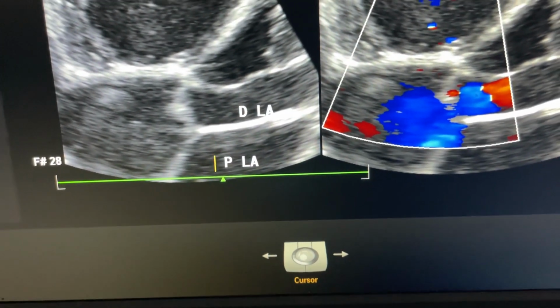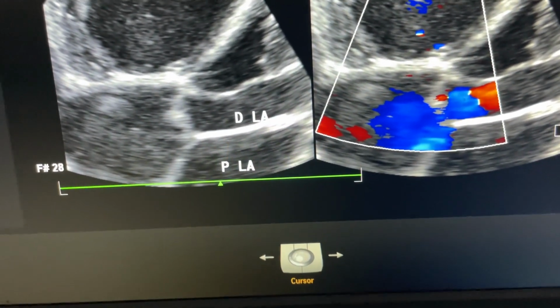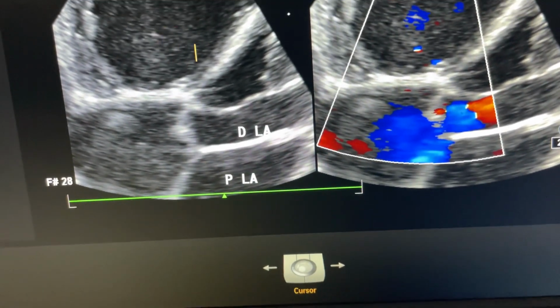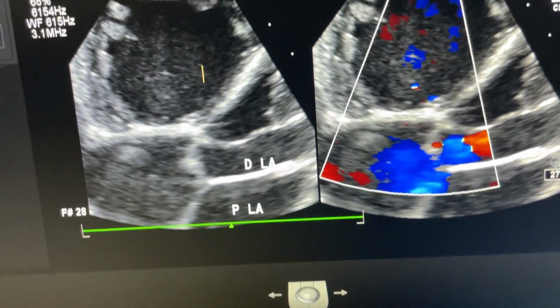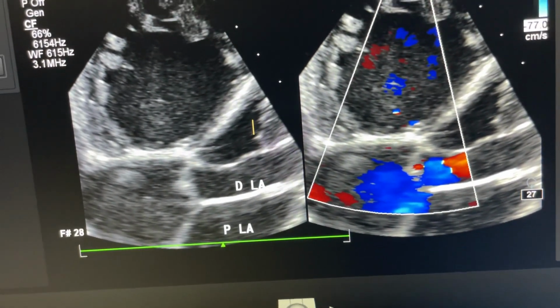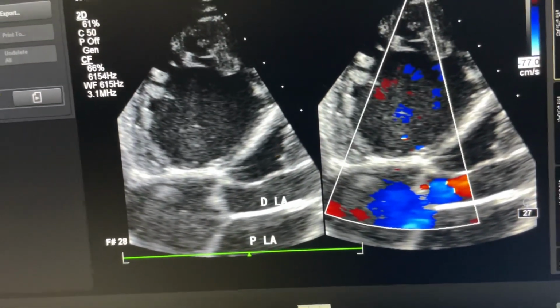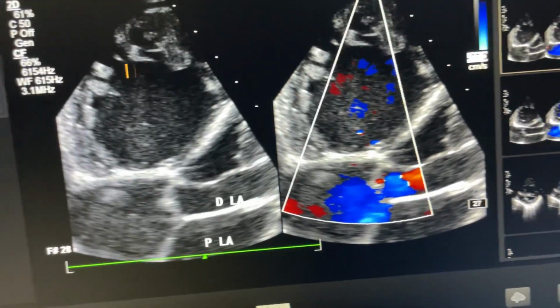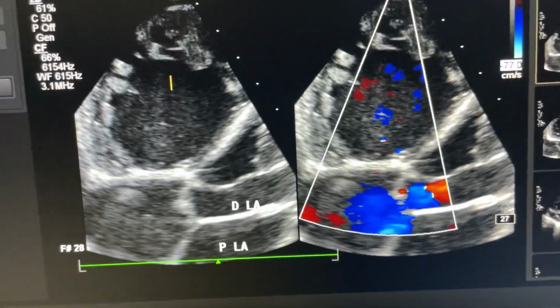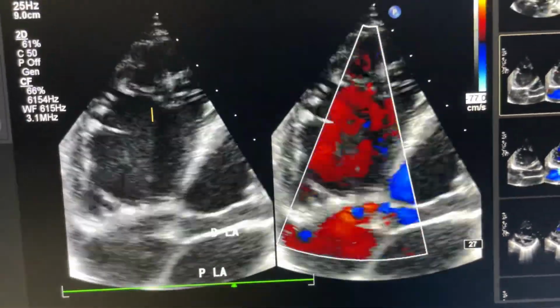High pressure is built in the proximal chamber, that is reflected upon pulmonary venous system, pulmonary arterial system, and right atrium, right ventricle. You see the right ventricle is severely dilated. You can easily see the size of right ventricle compared to left ventricle. Though the image is a little bit shortened in this apical four chamber view, this is mainly right ventricle. Right ventricle comes in better in this view. That is the point to know in this image.